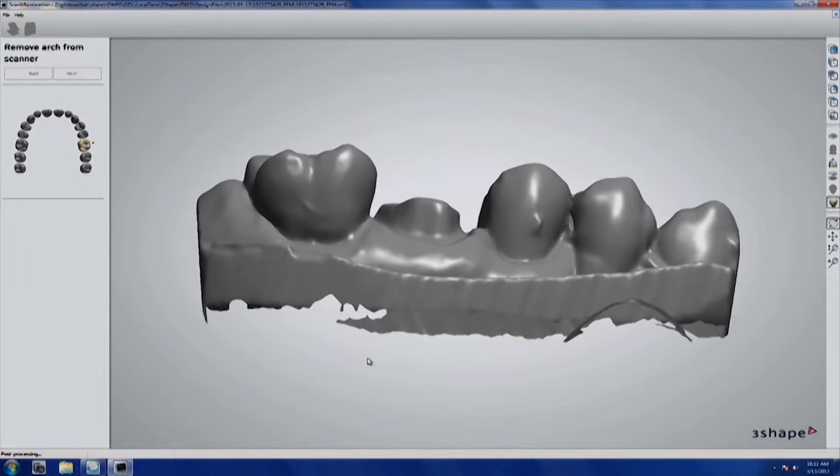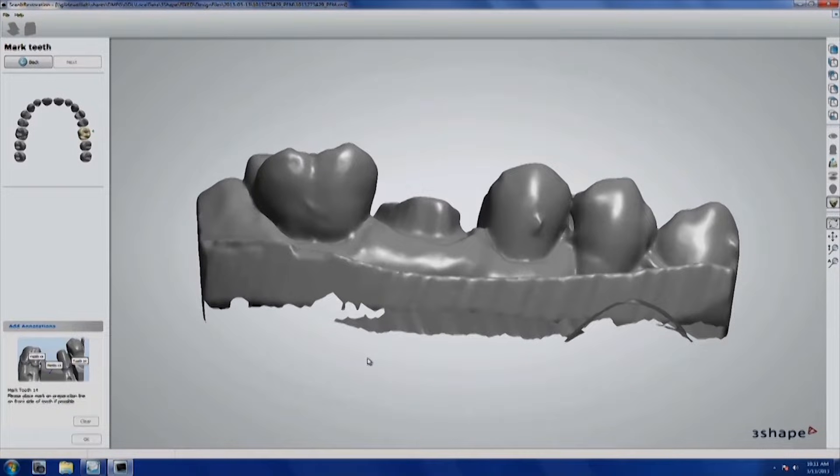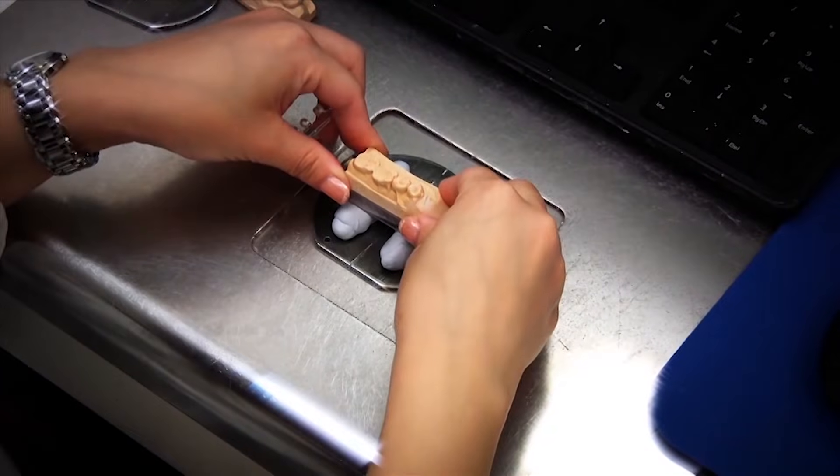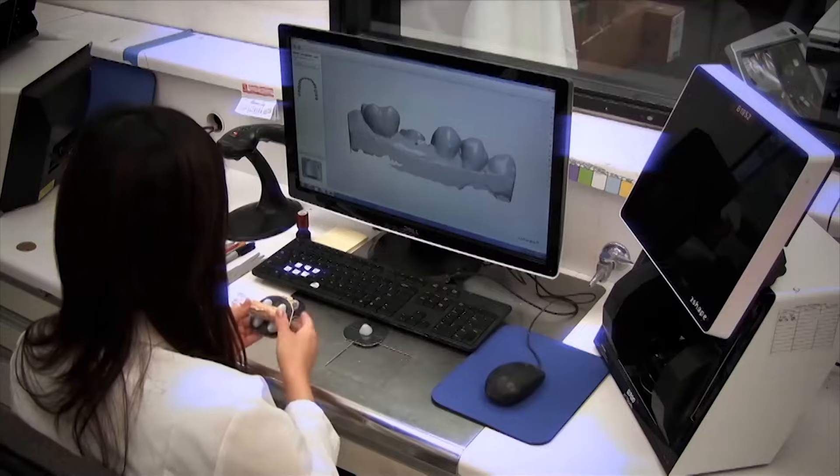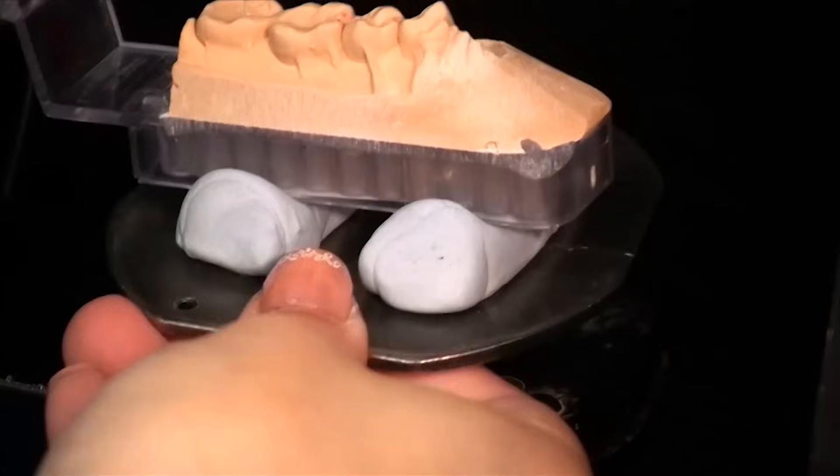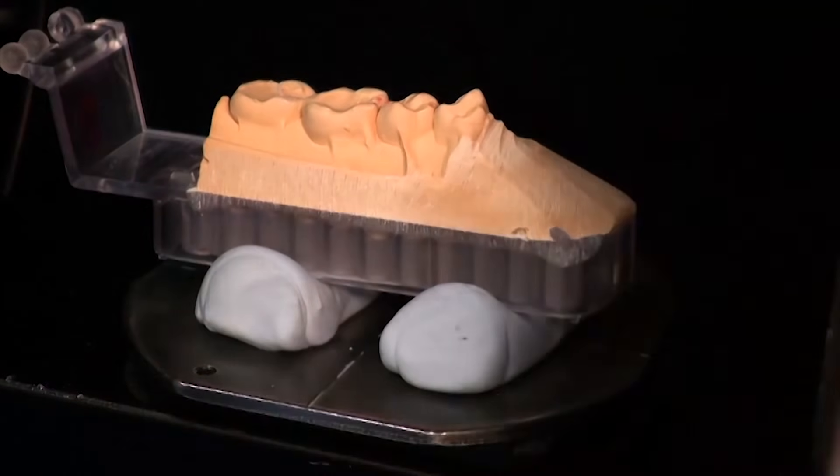If the dentist had sent a digital impression, then we would start right from that. But we had a conventional impression, so there's no really good impression scanners out there on the market. So we still have to pour the model in stone.